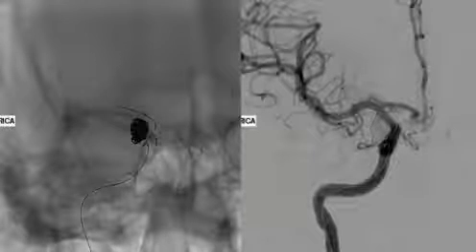On this picture you see the procedure just before it's finished. The aneurysm now is filled mostly with coils. Once the last coil is placed in the aneurysm and the aneurysm is packed as densely as we can, we take all of the catheters and the balloons out of the patient and get our final picture.